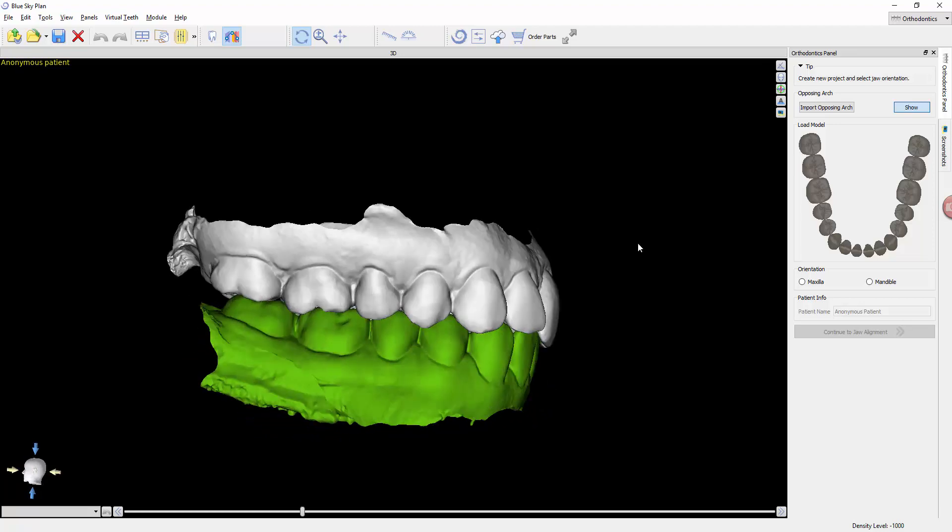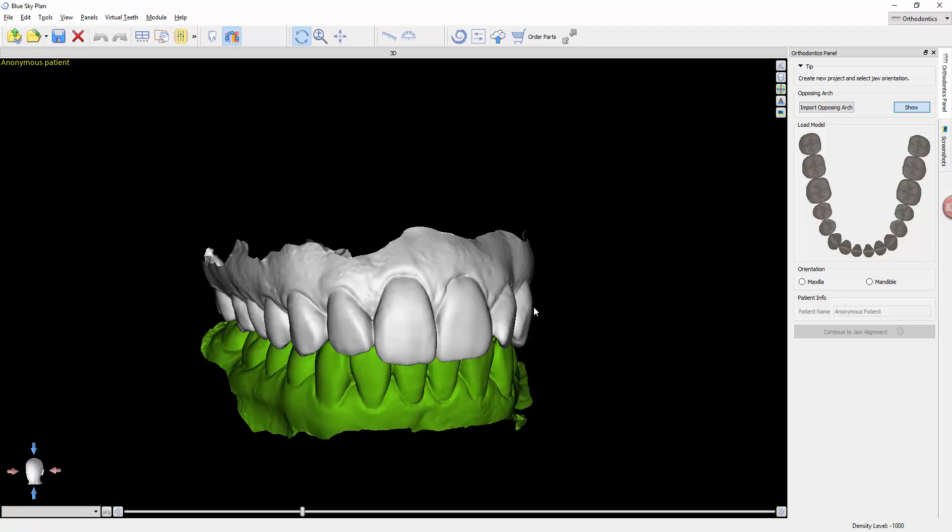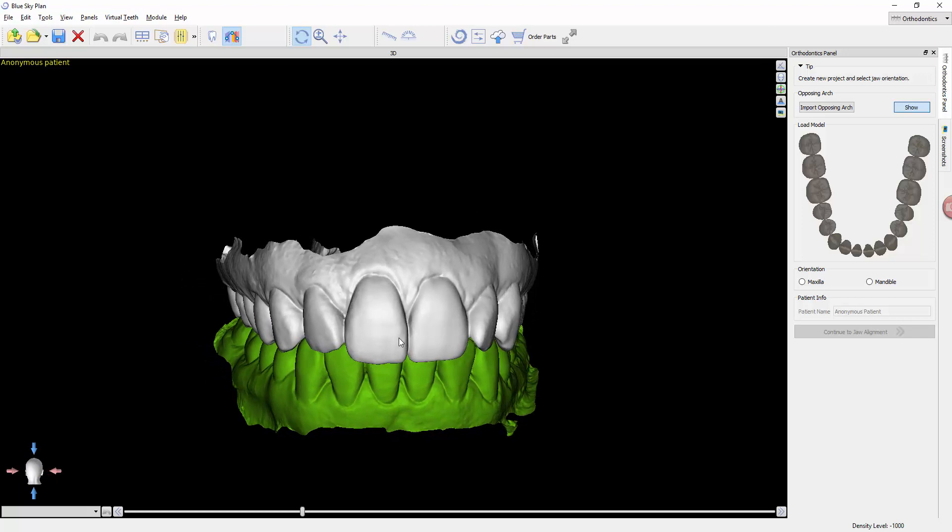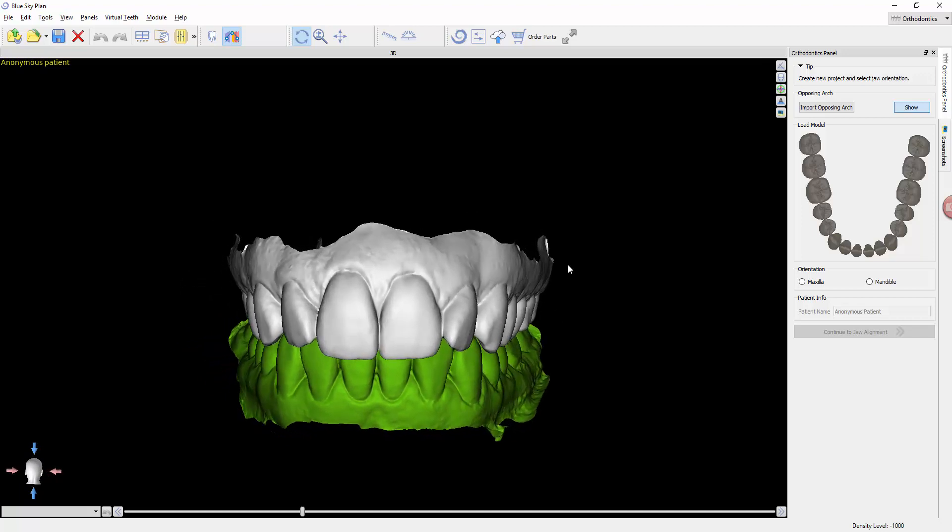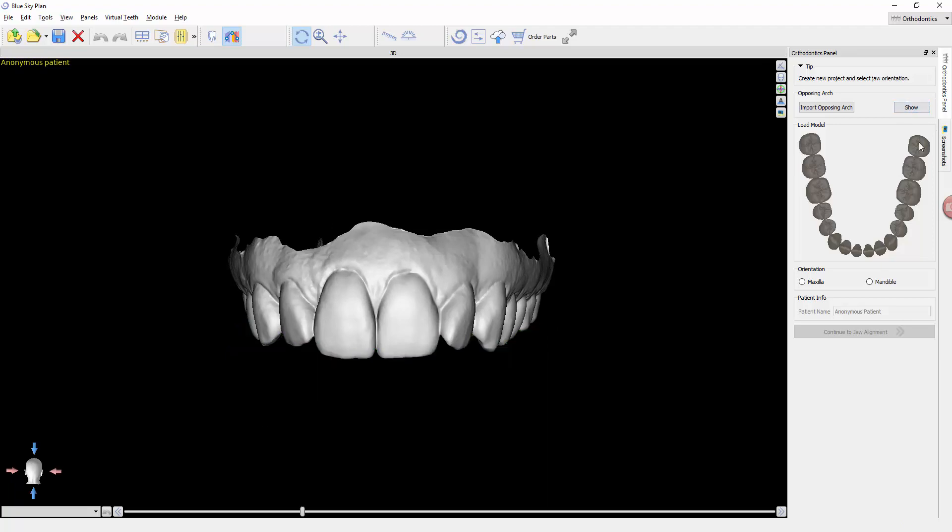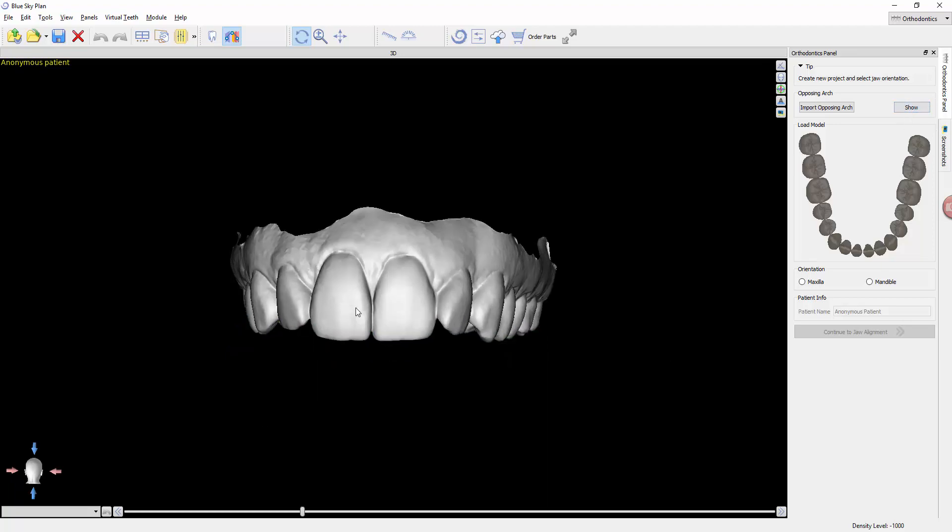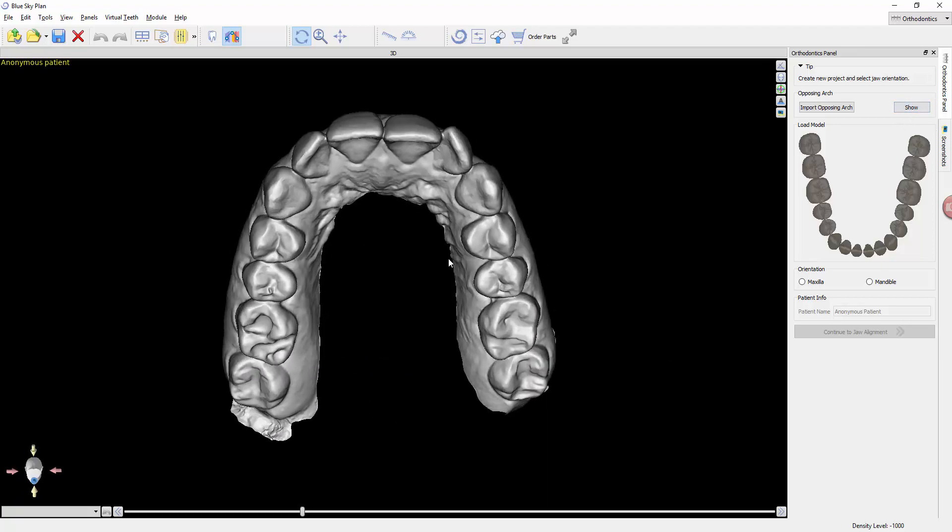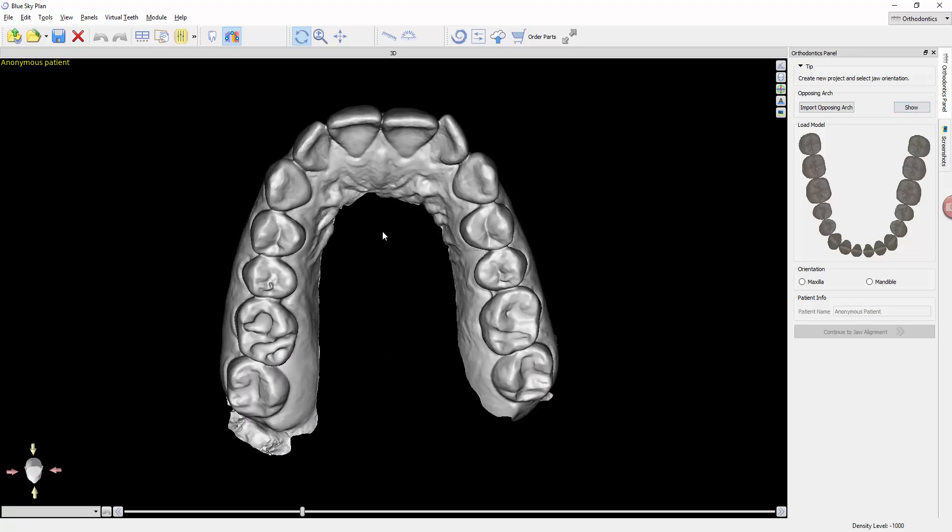Keep that in mind. The models should already be oriented before you bring them into BlueSkyPlan. So since we're going to be working forward on this upper arch, I'm going to go ahead and hide it by just unclicking the show button so that the lower model disappears.